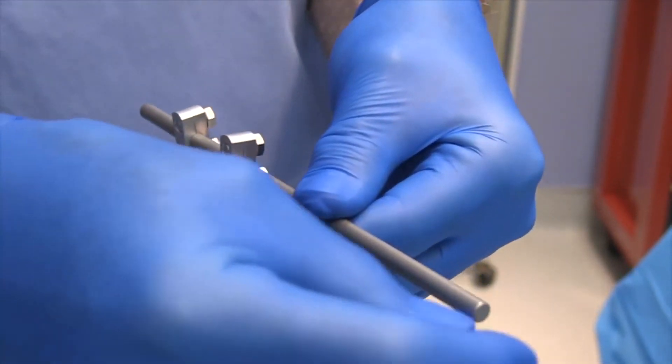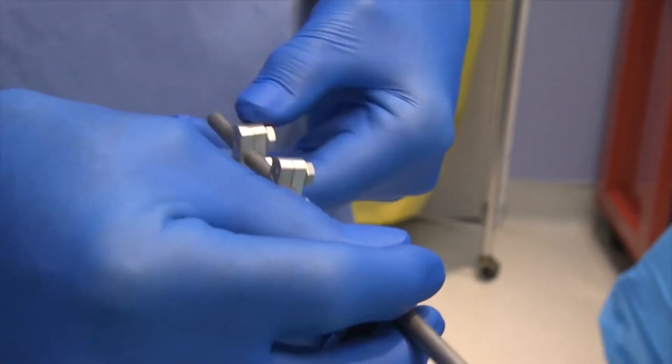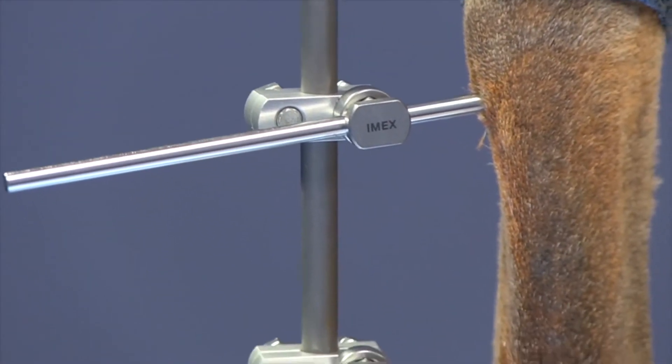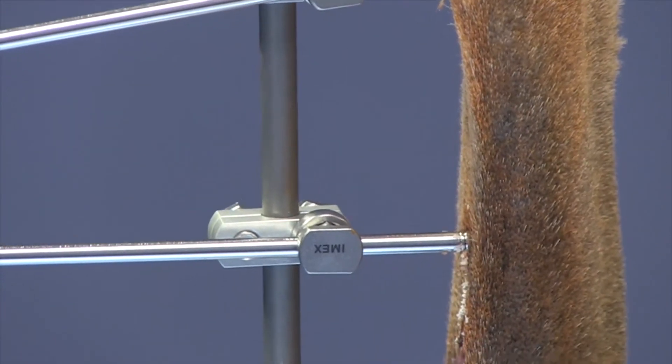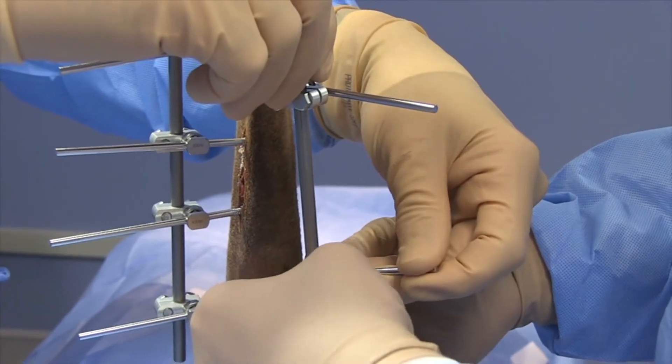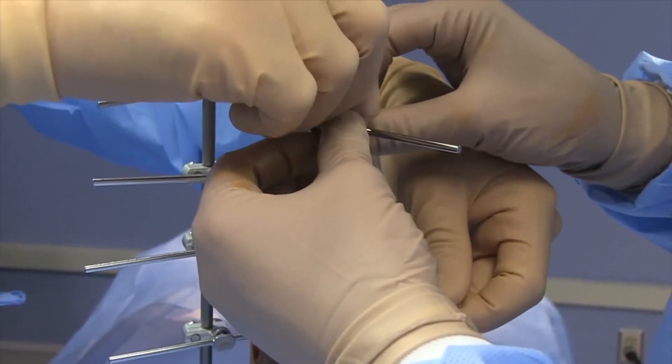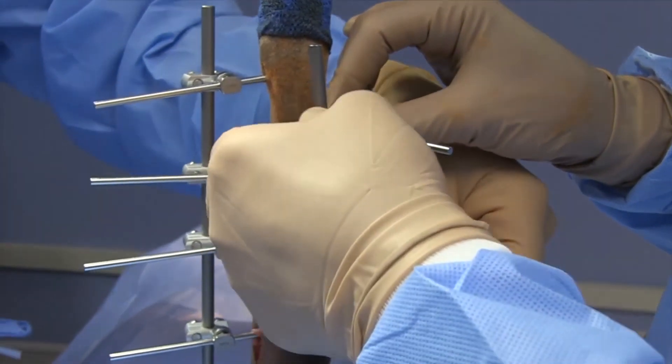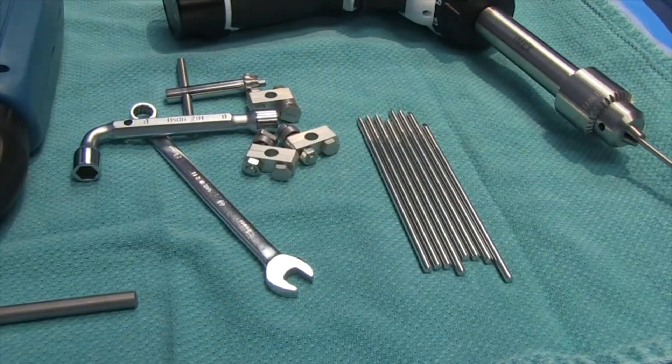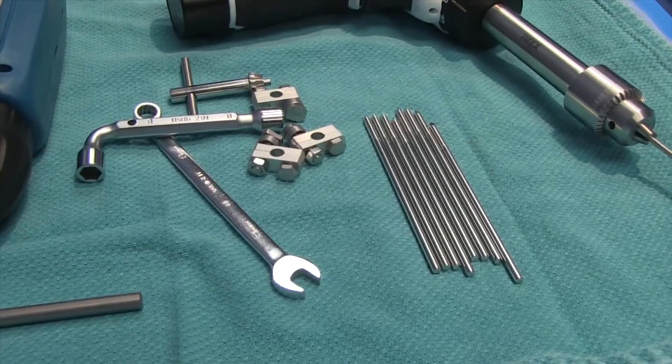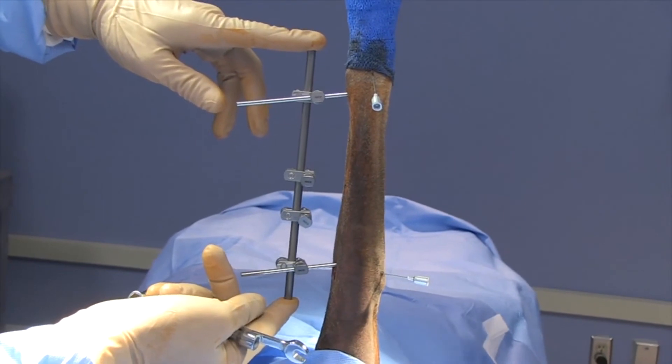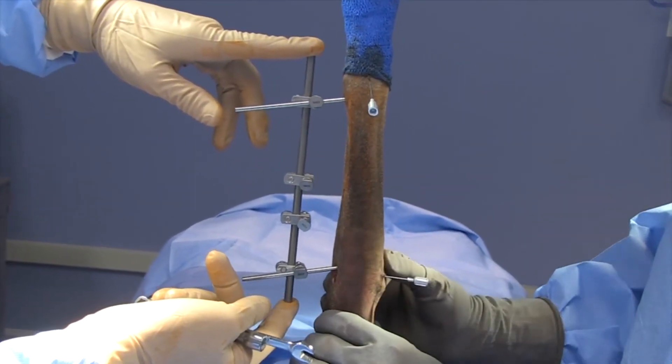Freedom of choice to construct a frame using not only the optimum pin diameter but also the optimum frame elements is a unique attribute of the IMEX SK system. In summary, the SK external skeletal fixation system offers the surgeon more pin diameter and bar size and type choices than any other fixator. With minimal instrument requirements for construction of simple but mechanically appropriate frames, the SK external fixation system is also the most cost efficient.